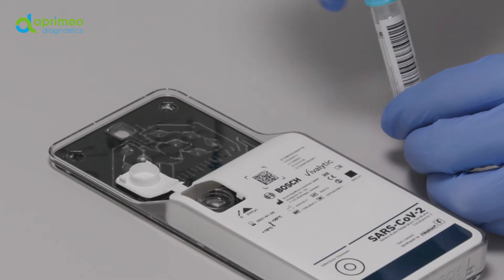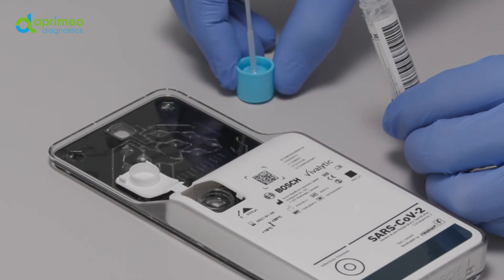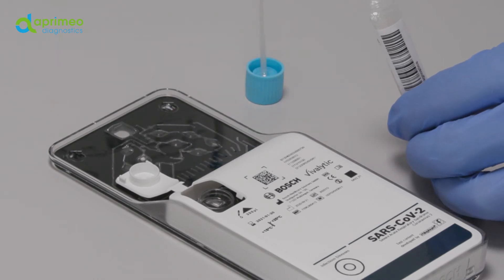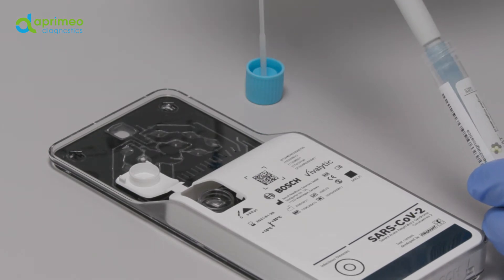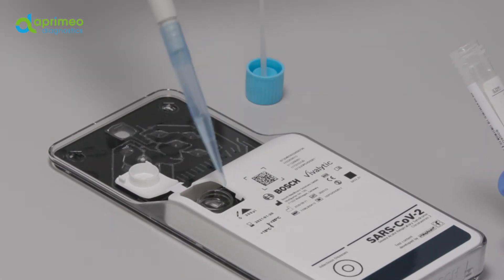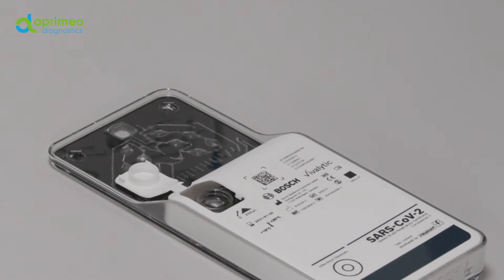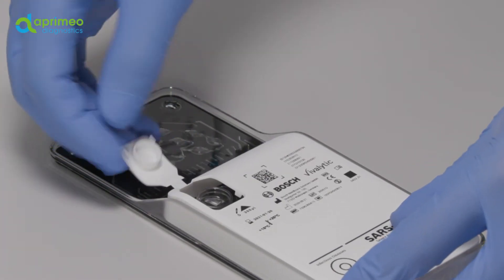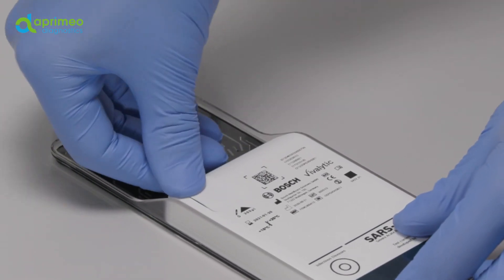Now fill the selected cartridge with the prepared sample. Place the cartridge on an even surface and inject the matching sample into the appropriate opening. The volume you need is also printed on the cartridge label. Please note that the wrong sample amount or a different type of sample may cause an erroneous result. Close the lid until you hear it catching with an audible click. After this, you cannot reopen the lid.